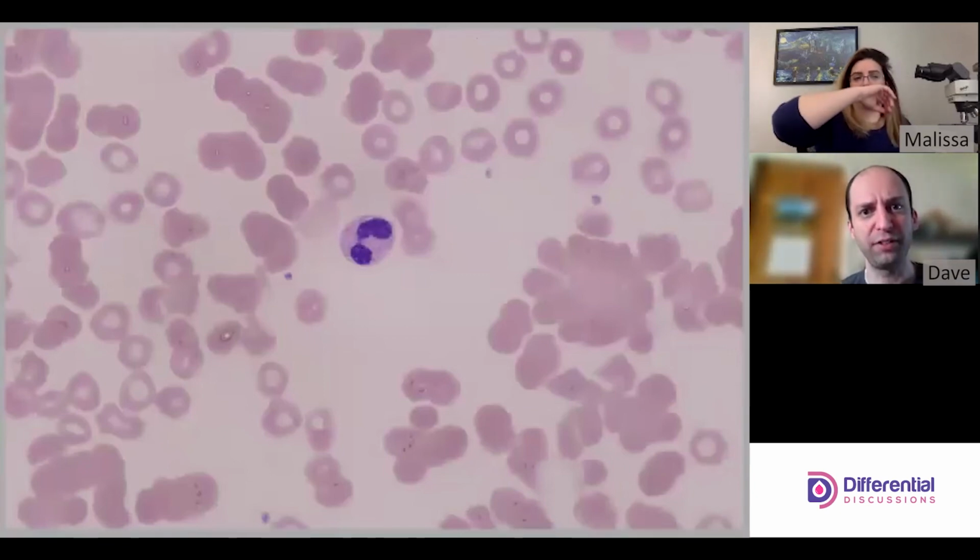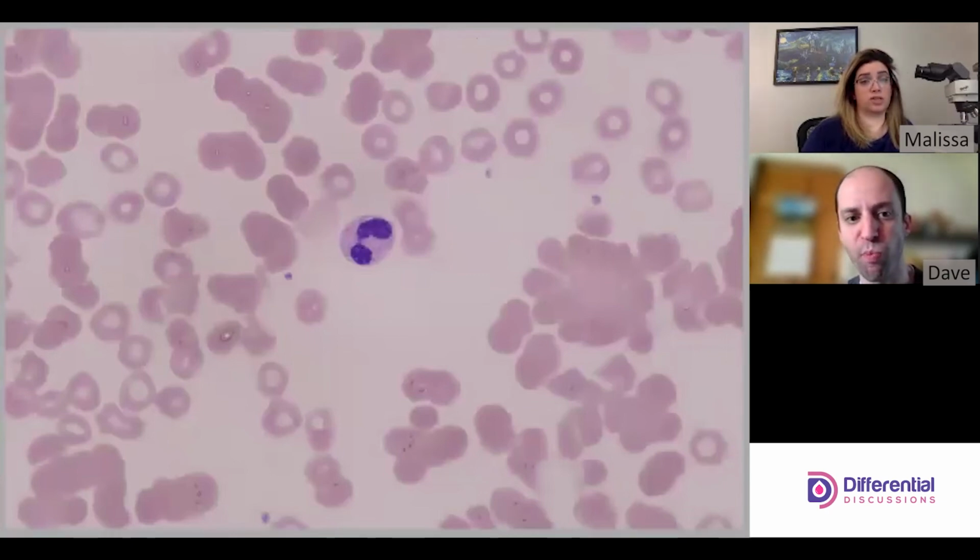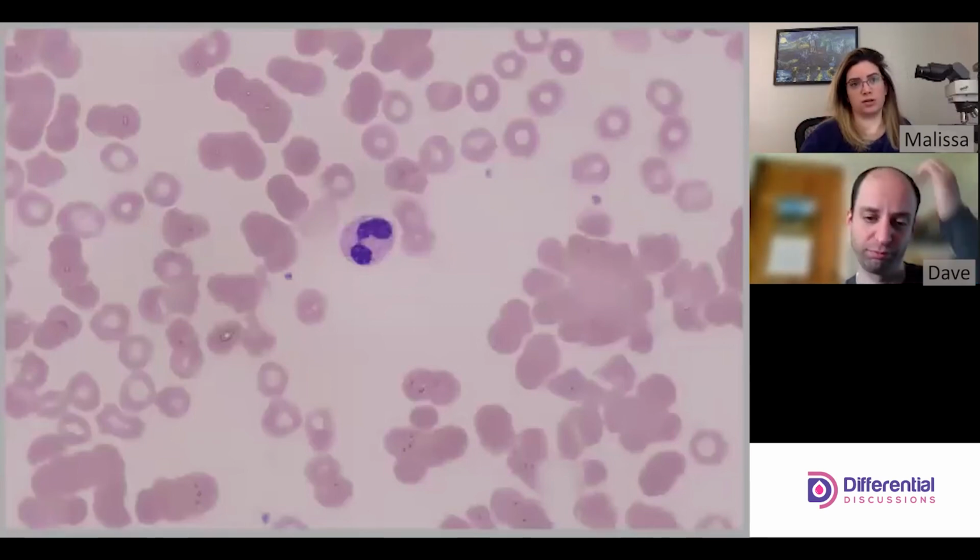We have to tell the clinician that this phenomenon is going on. They want to know that they have a possible cold agglutinin or something. Absolutely. So you need to report out the agglutination in some way, shape, or form, regardless of whether you clear the agglutination so that you can run it and get the real results, but you still need to report the agglutination.